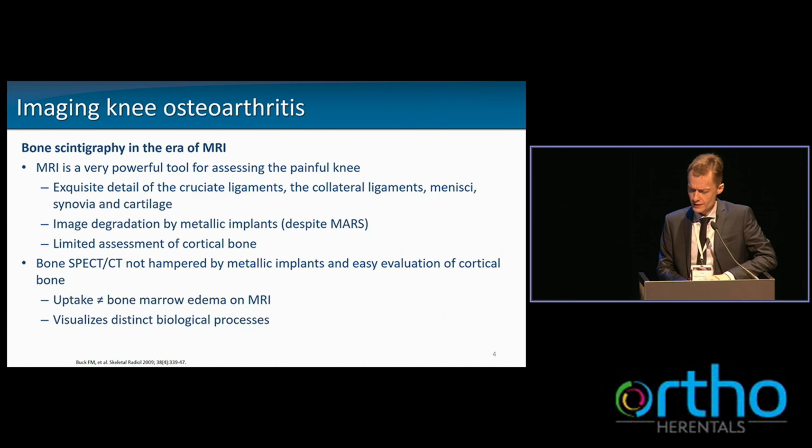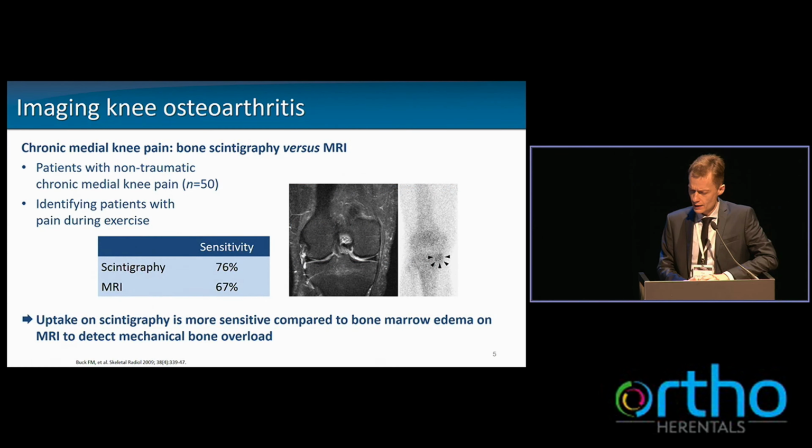Another common misconception or confusion in the literature exists about bone marrow edema on MRI being the same as uptake on bone scintigraphy. However, I do not believe that is the case. There is definitely overlap, but there is data showing that both actually visualize distinct biological processes. And that was shown in a study in patients with chronic medial knee pain, where bone scintigraphy was compared with MRI. And all patients had non-traumatic chronic medial knee pain.